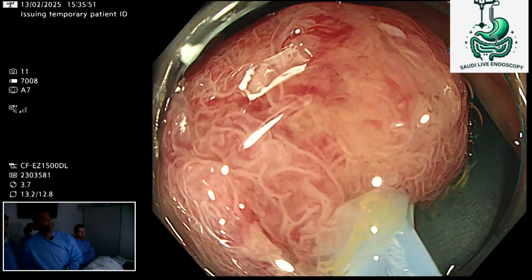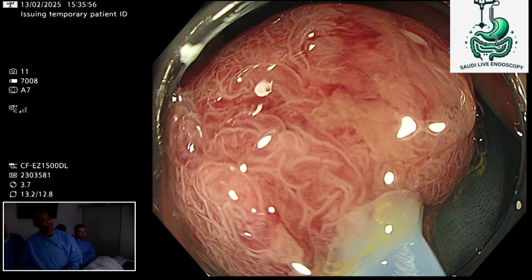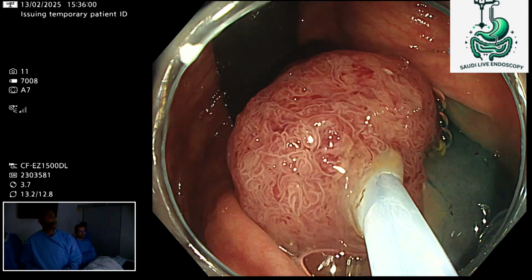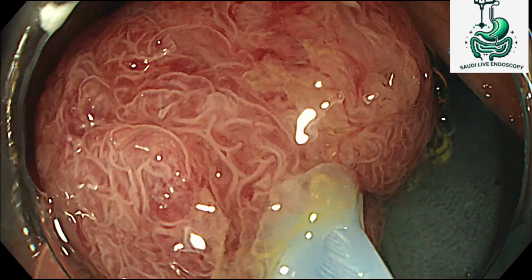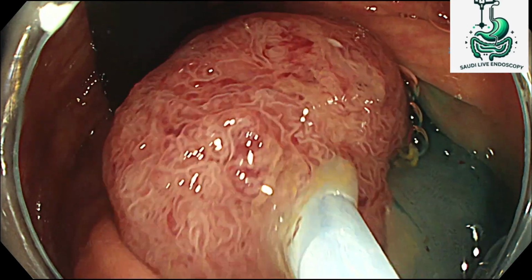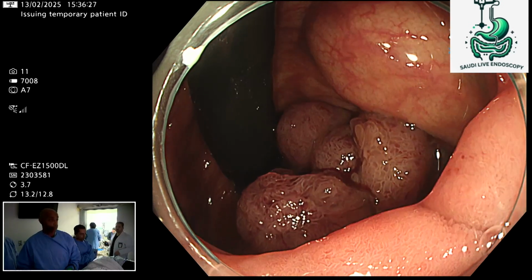Okay. So now I'm going blind because there's a piece there, but I'm checking mobility, and relative to the rest of the wall, it seems to be free. So after each cut, we have to examine the base of resection to ensure there's no bleeding and there's no deep mural injury. That has to be treated before continuing the resection.